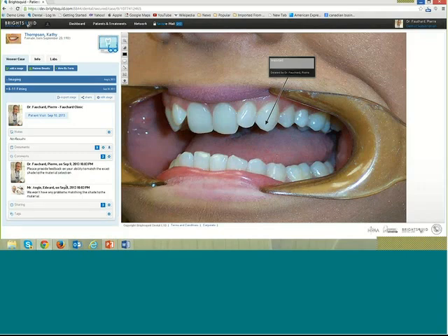The exciting part about where this technology goes is after that collaboration during the patient treatment between the dentist and the specialist team, it will go to the lab, who is a key customer or key stakeholder in the delivery of the treatment. All of the information that's relevant can be taken and shared between that lab, the Digital Design Center, and the Milling Center to actually produce an implant. So it takes it through the full circle. It's a pretty exciting trend in digital dentistry, something that obviously is going to change the very nature of it.